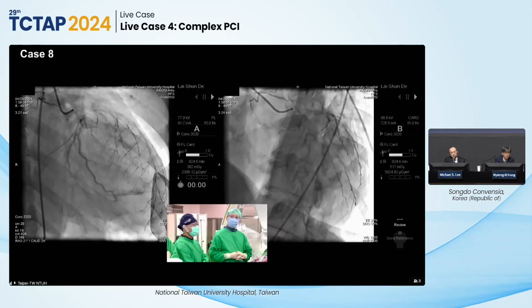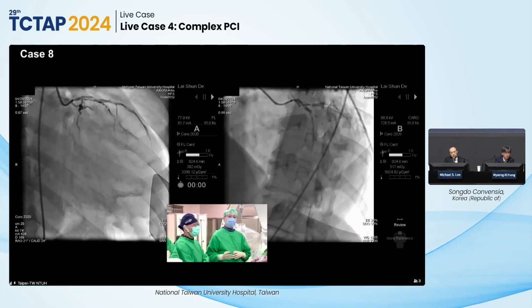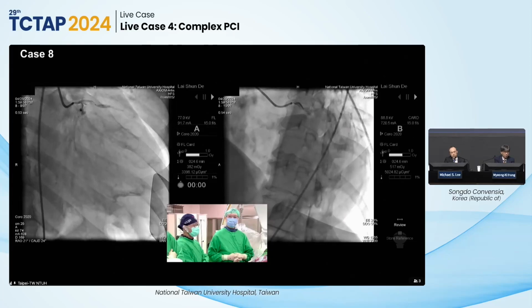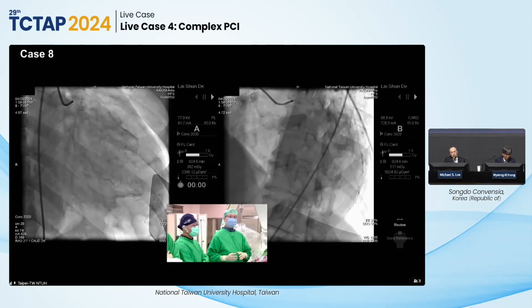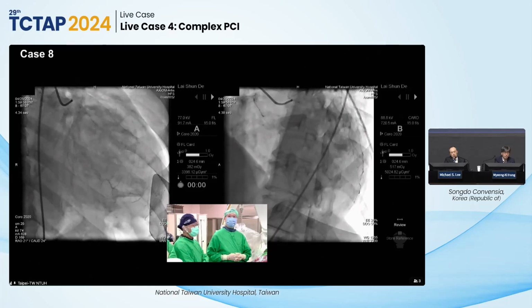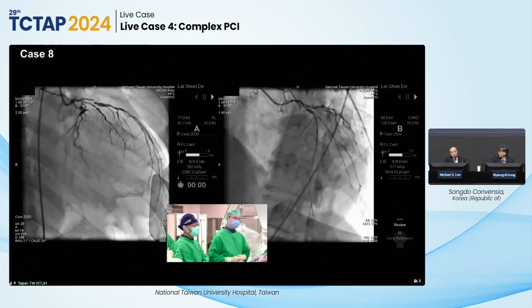And from the ECG, there is not much Q wave except for the previous inferior Q wave. So although we didn't have a viability test, the patient was really in a low LVEF state. And we did not perform myocardial perfusion imaging this time. I think it's maybe risky in this kind of low EF to perform the stress test.